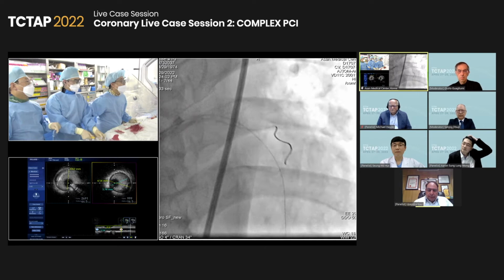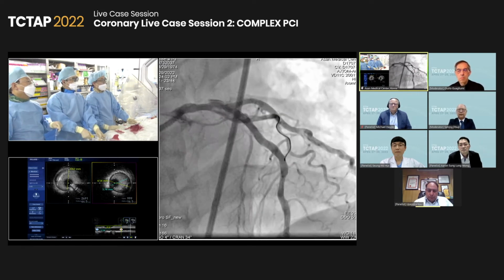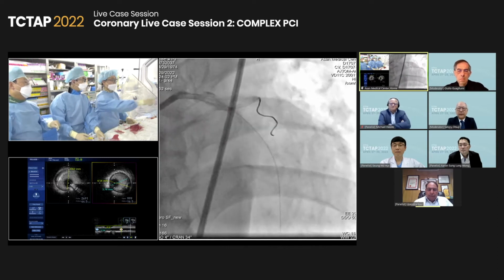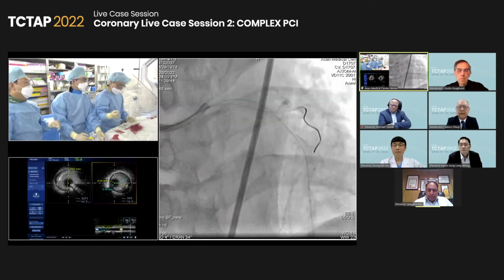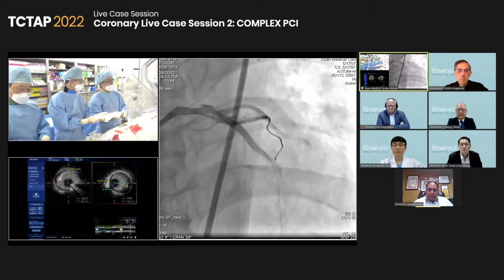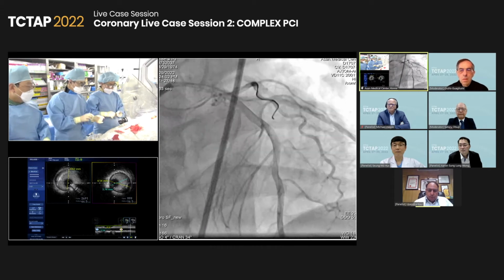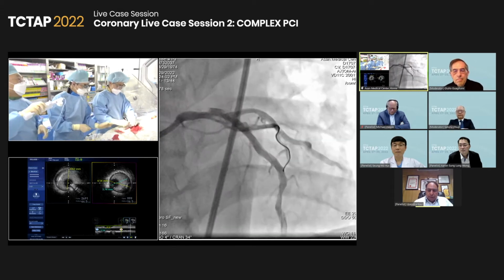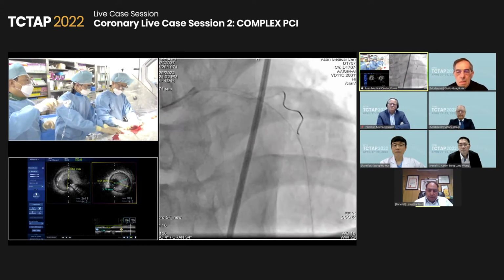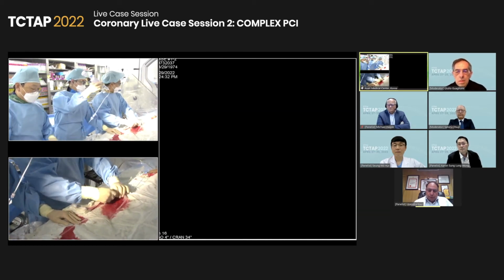And I think I would agree to go with a 4mm stent and then do a POT using a 5mm NC balloon and dilate the proximal portion of the left main. And I'd like to end up by doing an intravascular ultrasound to confirm the apposition and also to see the vessel just distal to the edge of the distal portion of the stent.